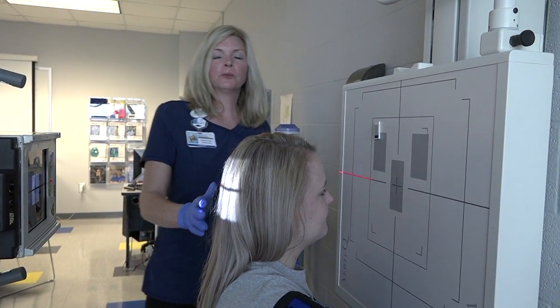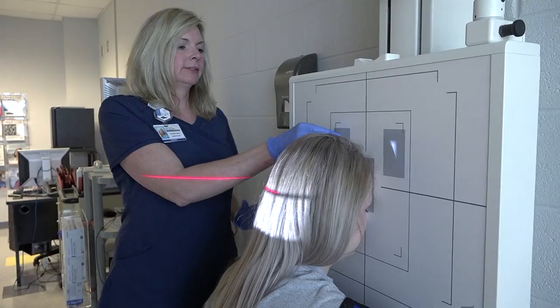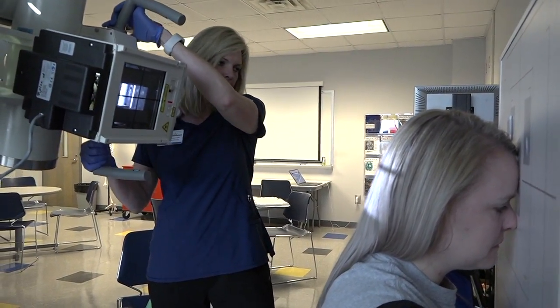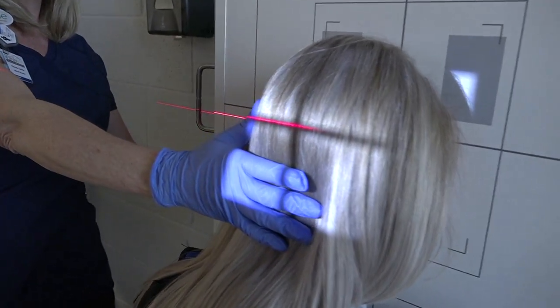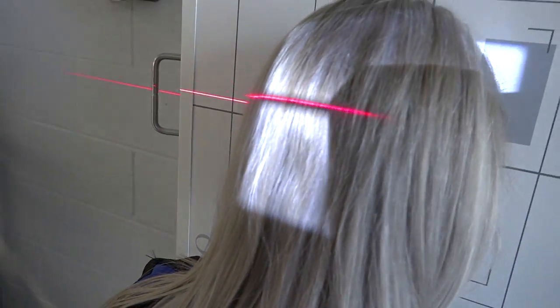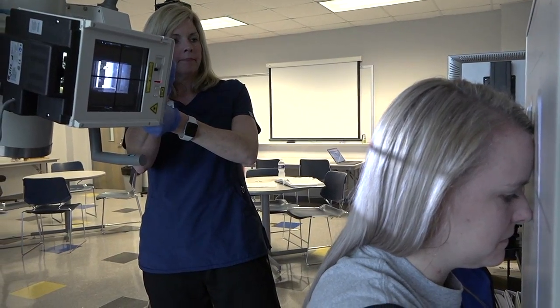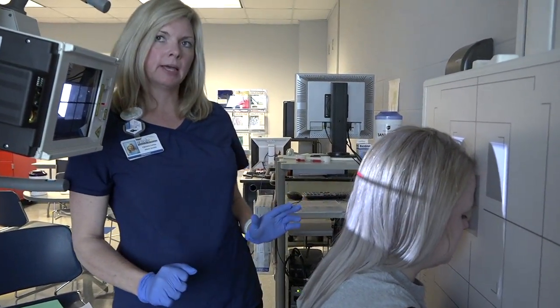Our last projection with the facial bones is the PA Axial Caldwell. We'll put the nose and forehead on the board — it's the same 15-degree angle — with the central ray to exit at the nasion. We'll move the bucky down to the bridge of the nose, then line up our laser with our centering point. We want to make sure there's no rotation or tilt and that our central ray is down the mid-sagittal plane.